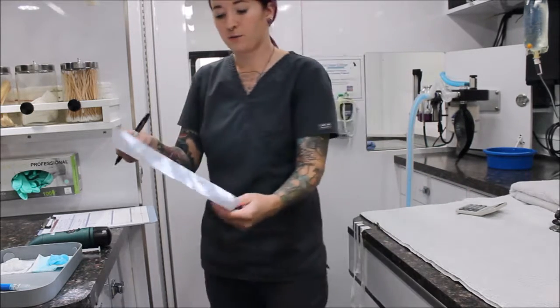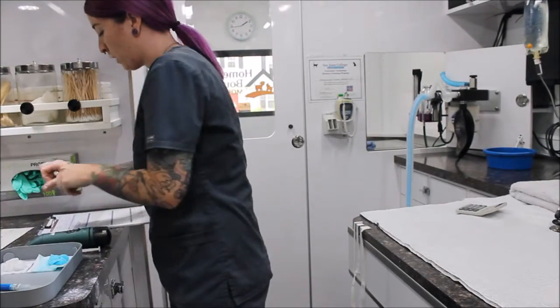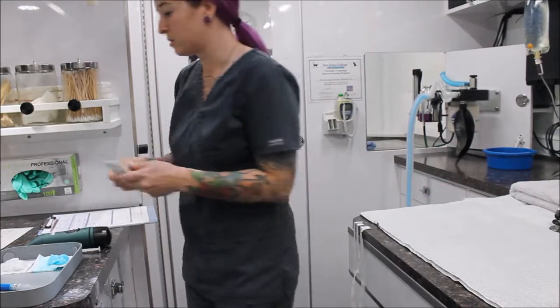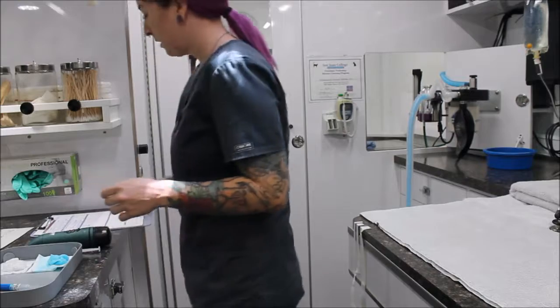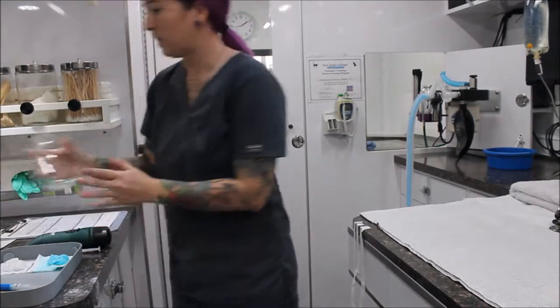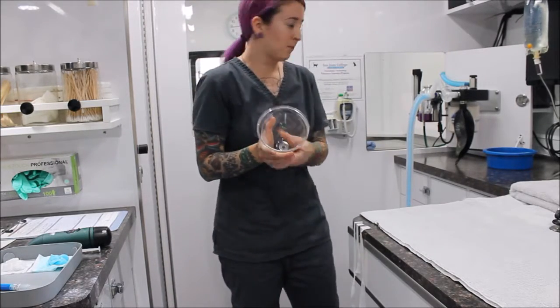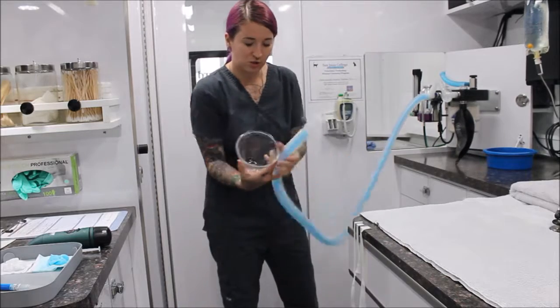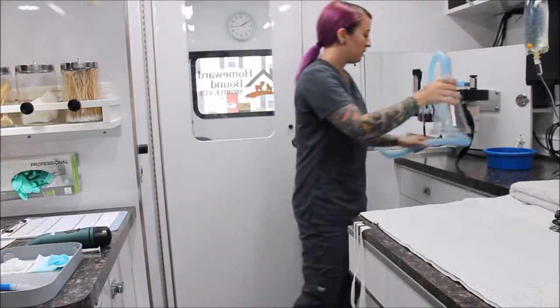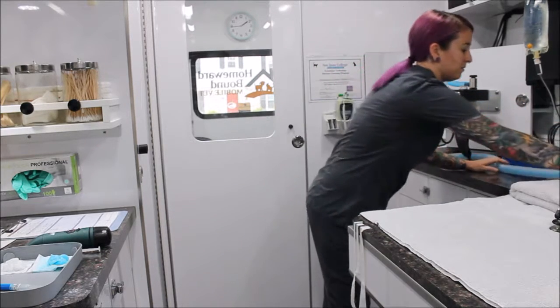So now that I have those doses calculated, I'm just going to go ahead and write those on his anesthetic log, just so we know what appropriate doses of oxygen are for him. So the next thing I'm going to get prepared is making sure that I have a mask ready for pre-oxygenating him during induction or before induction. We usually do that for about 5 minutes. I'm just going to attach that to my hose here and just put it right over here.